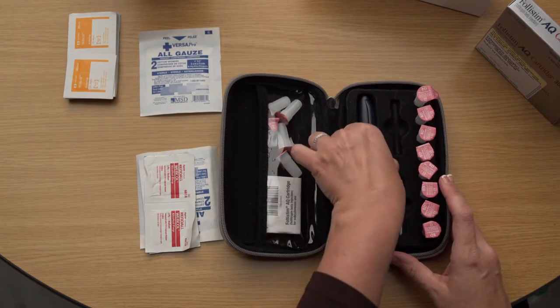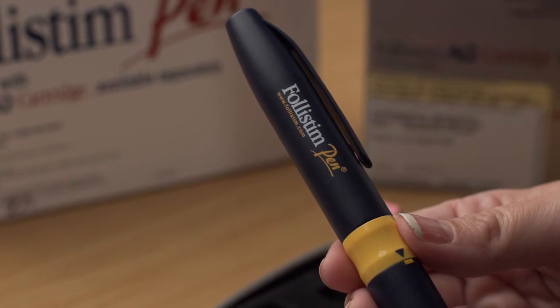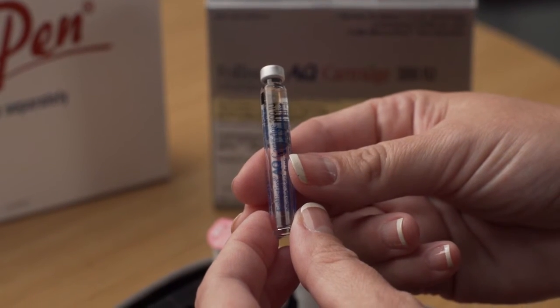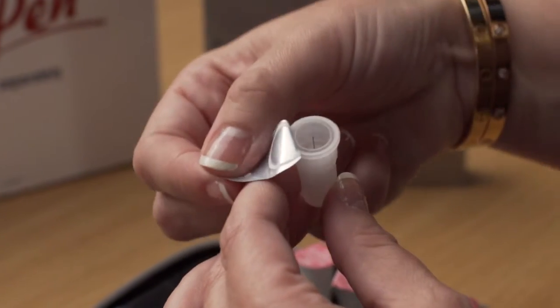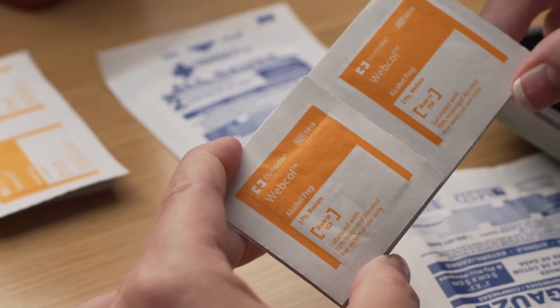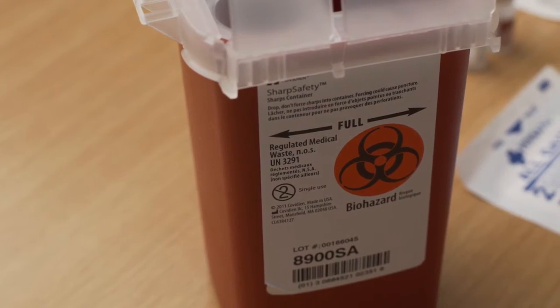Before you begin, be sure to have all the following items: one Follistim pen, one Follistim AQ cartridge, the BD Microfine pen needle provided with the cartridge, alcohol swabs, sterile gauze, and a safety container.